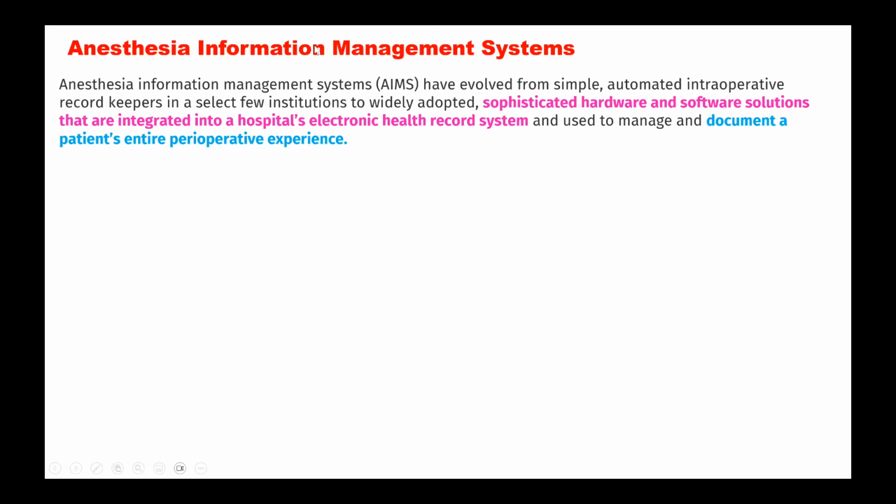So that is the two parts of that. This concept gives the information about the patient, his preoperative condition, his intraoperative behavior, and what the post-op problems or behavior of the patient in the post-op phase are. All the information is given to you.